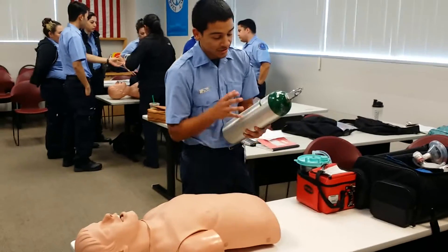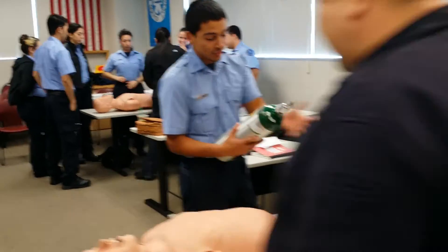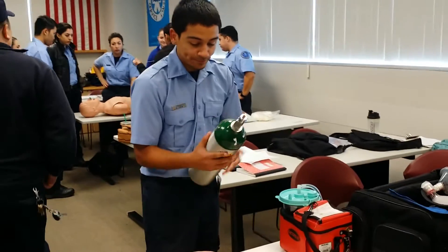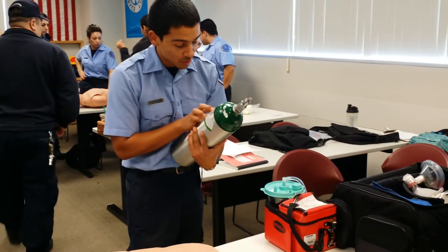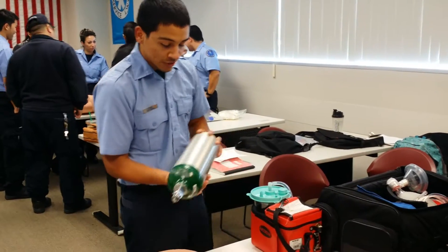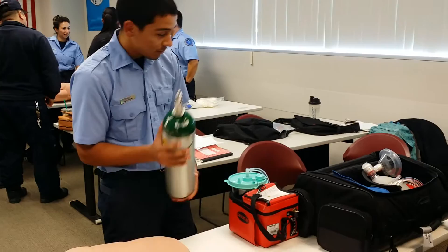This is my oxygen tank — my oxygen tank. I know it's oxygen because the universal color for oxygen is green. Looking for expiration date — right here, October 2015. Looking for any structural damage. No structural damage.